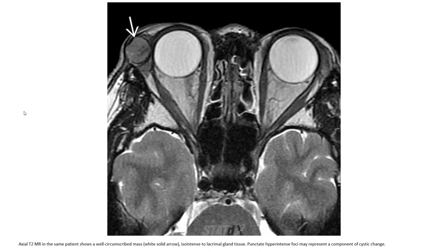This is the axial T2 of the same patient. A well-circumscribed mass, indicated by the white arrow, is isointense to lacrimal gland tissue. The focal hyperintense area represents a component of cystic change.